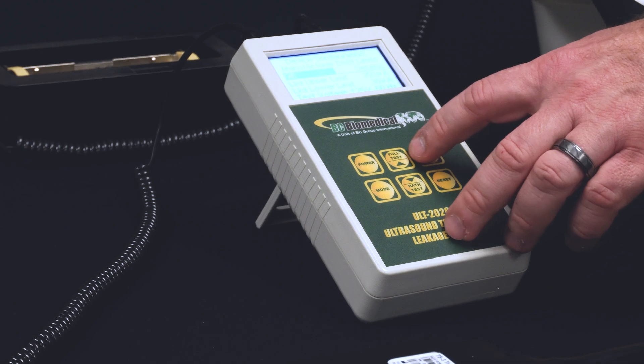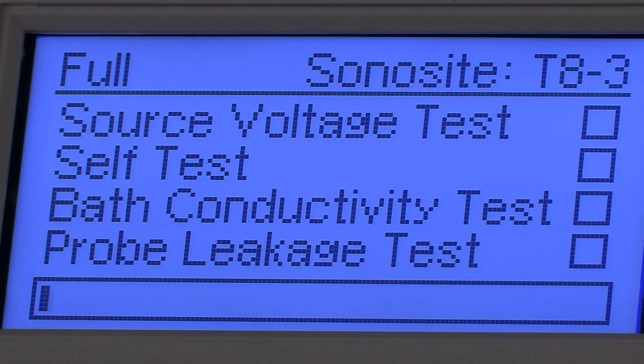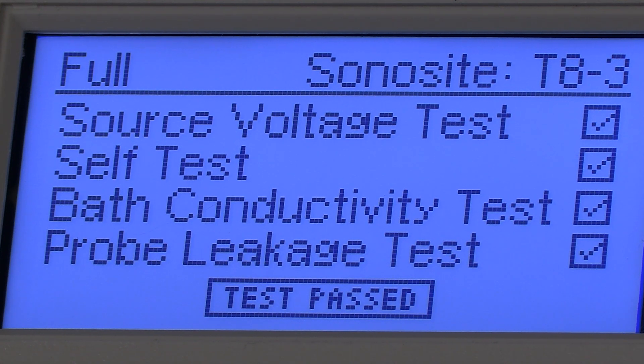Lastly, simply press full test to begin the test. The ULT-2020 will automatically test and analyze the ultrasound transducer to ensure it is performing within the specified tolerances. When finished, pass or fail will appear on the screen indicating your results. If a printer is attached, the results will print off in detail along with a pass or fail.